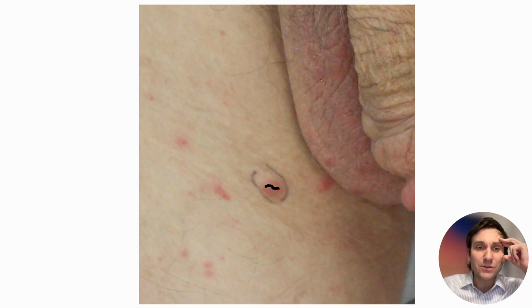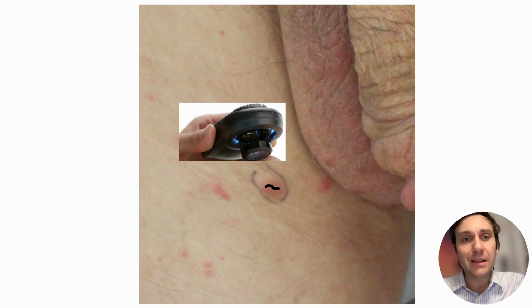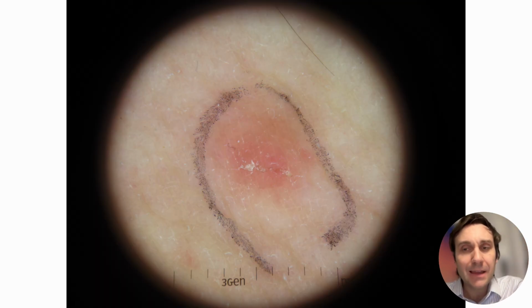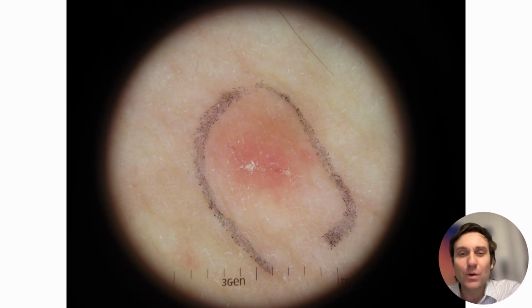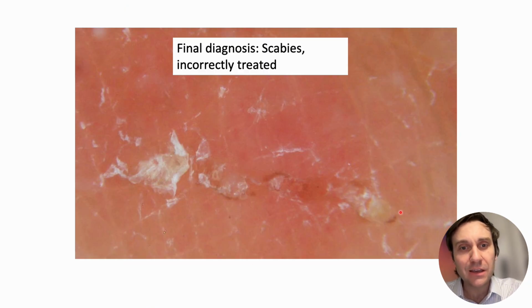With this magnification, you sort of see this linear structure, but now we use our dermatoscope, right? And what do we see here? This is the way you see it with your eyes without magnification. You always learn from the books and you see this huge delta sign. This is the real size, right? So this tiny, tiny area here, I'm going to zoom it for you. Tiny area here, more zoom for you. And you see here the triangular-shaped delta sign.